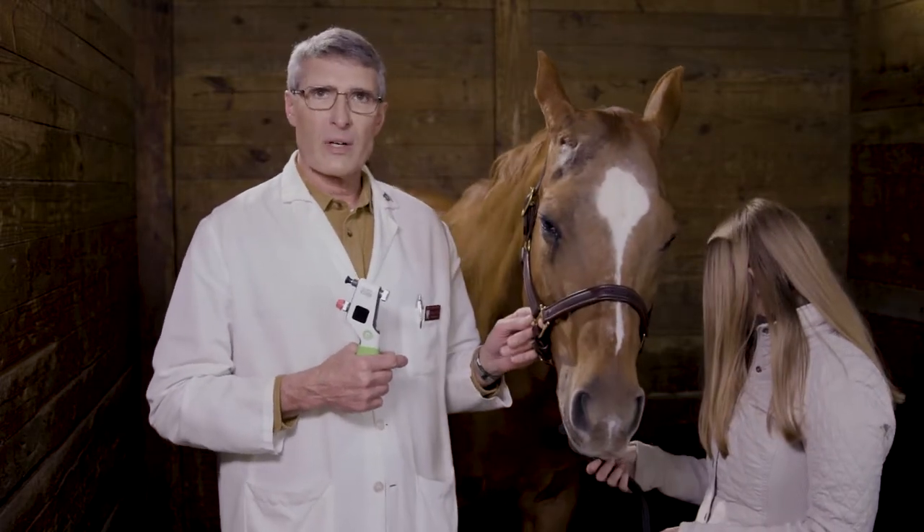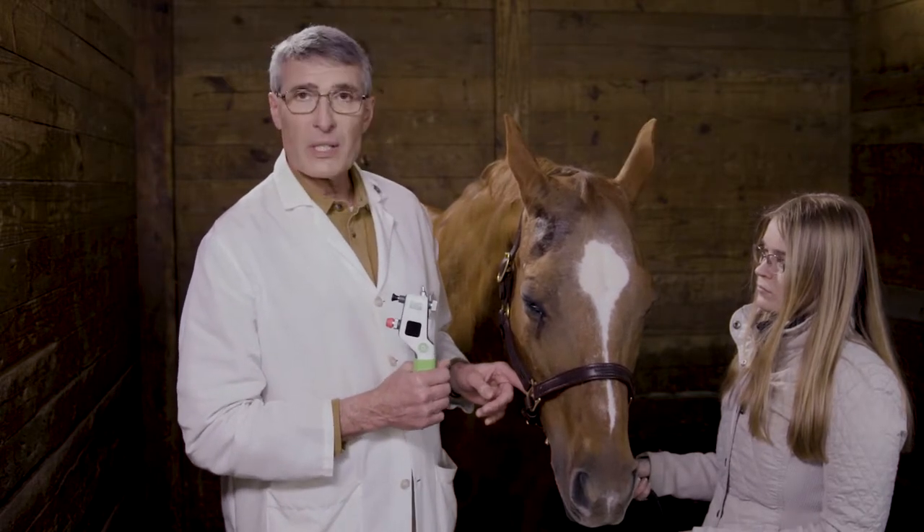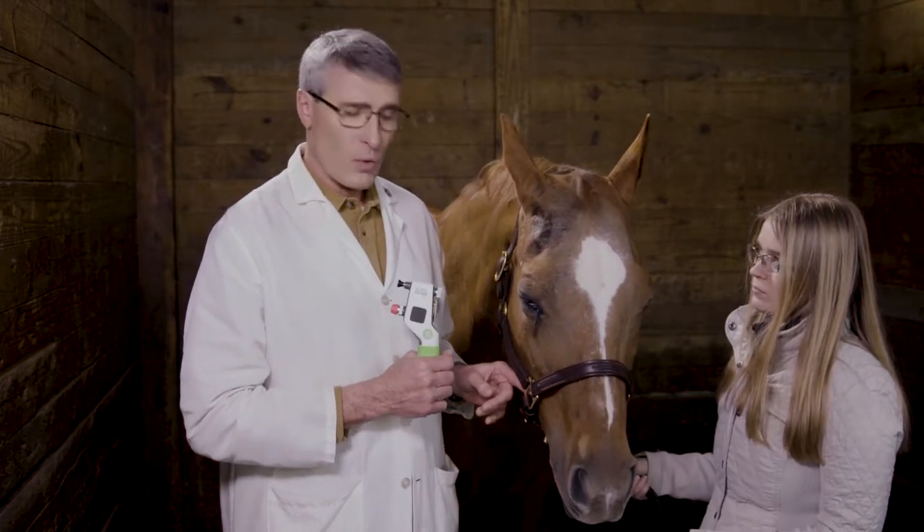The way that you're going to measure intraocular pressure is with an automated instrument. Here we have the Tonovett Plus made by iCare in Finland, distributed in the United States by Jorvet.